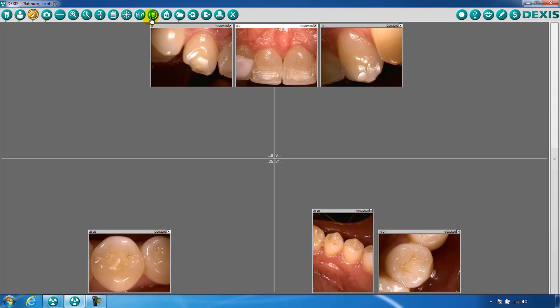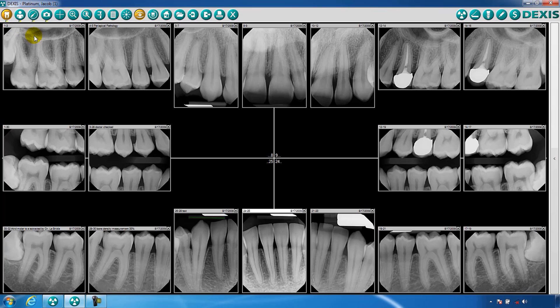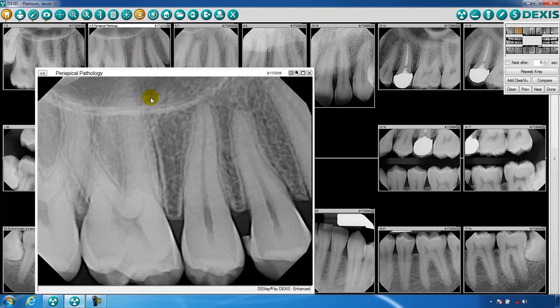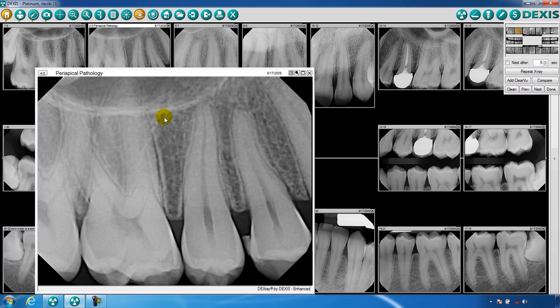The mirror icon is available on the toolbar for DEX-Image images. We will begin with clear view. Clear view is an enhancement tool used to sharpen and contrast images, making them clearer and sharper. Once clear view is turned on, it will be active and applied to all images and for all patients until it is turned off.